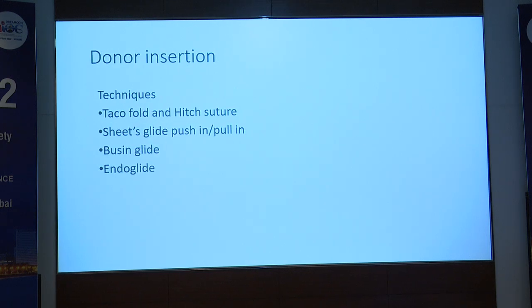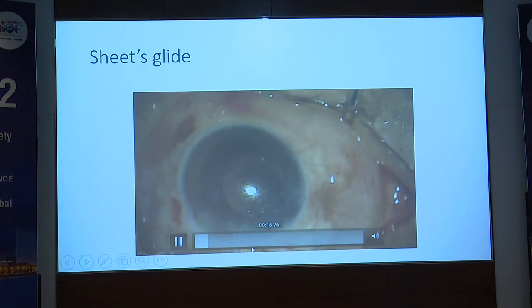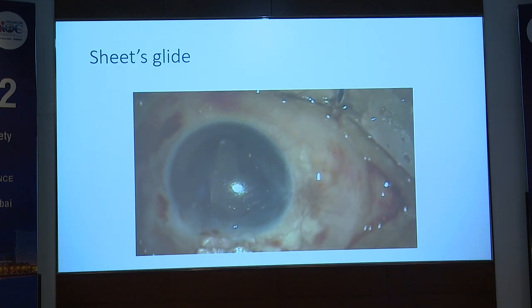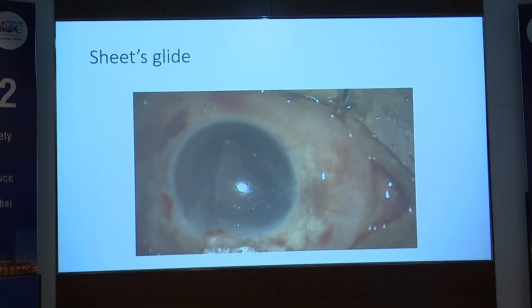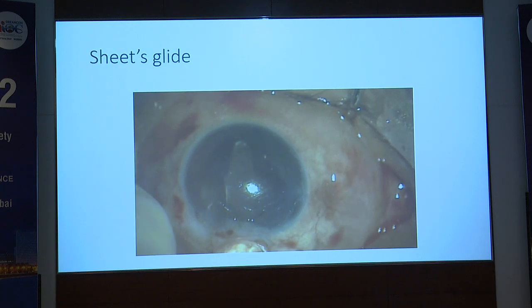Donor insertion, the easiest technique is to use a sheet glide. Place a cohesive viscoelastic on that, and you can use your bent 26 gauge needle or a Sinskey hook to just push your endothelium, the graft, into the anterior chamber. And it's always going to be the correct orientation of your graft because you're placing it properly into the anterior chamber, and there is no question of it opening the reverse side down. And it's one of the easiest techniques which anybody can follow.